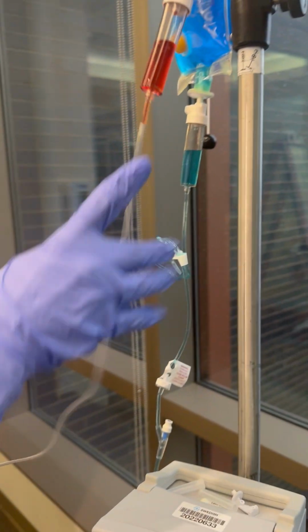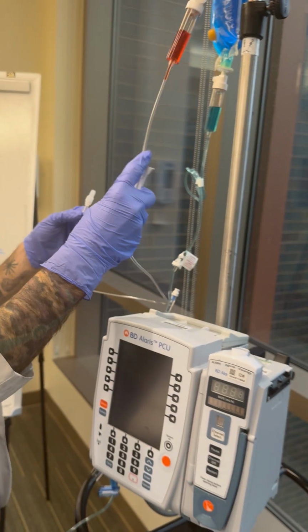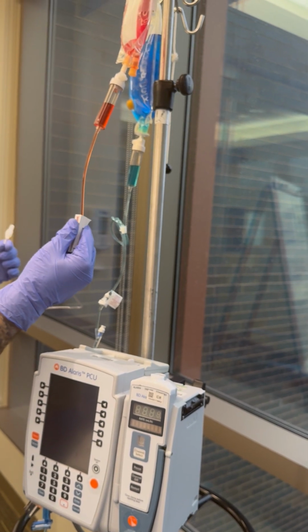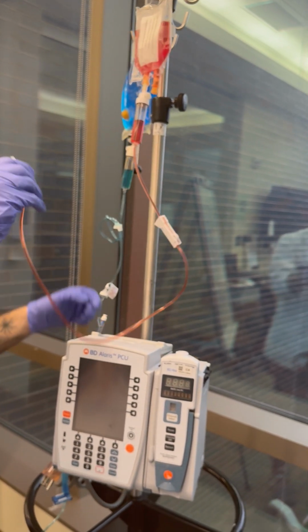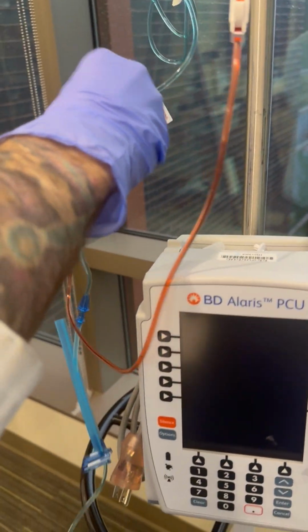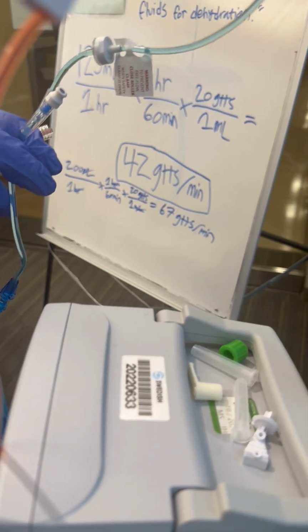I can do one of 2 things. I can prime this out and then hook it up. Have you all seen the other way how to do it? You have to put the bag lower than the other bag or something? Basically, so we'll make a little color cocktail here. So I'm only priming this out just to show you the colors. Let's pretend this had a cap on it, because I ran out of alcohol pads. So let's say that was on there. Okay, it's nice and clean, ready to go. Granted, I didn't touch it, but still. Not best practice. That's diagonal.